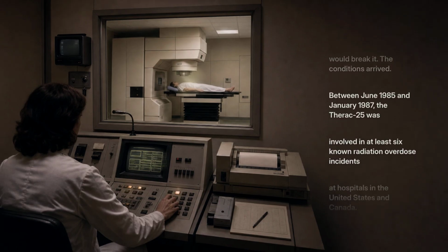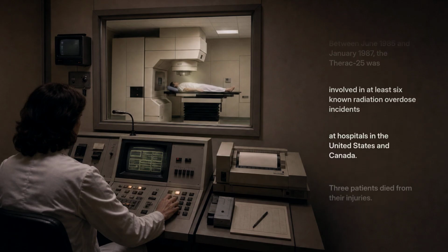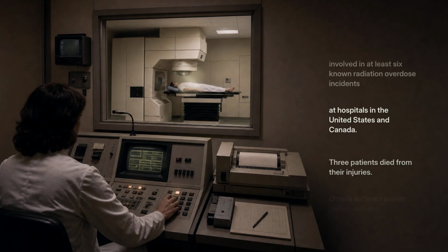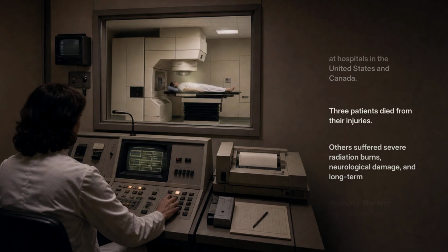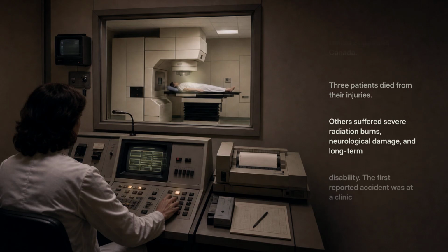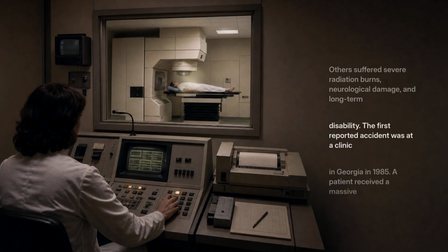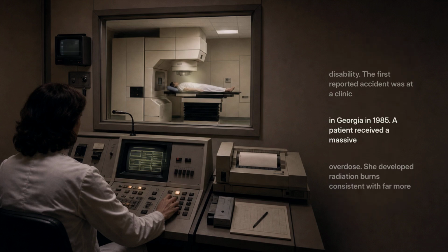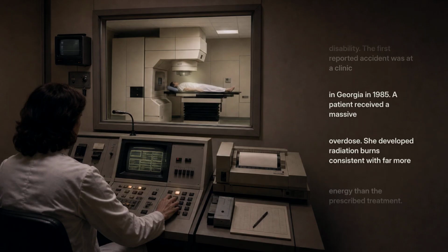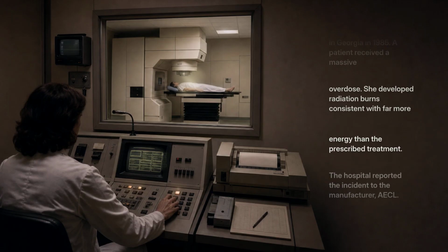Between June 1985 and January 1987, the Therac 25 was involved in at least 6 known radiation overdose incidents at hospitals in the United States and Canada. 3 patients died from their injuries. Others suffered severe radiation burns, neurological damage, and long-term disability. The first reported accident was at a clinic in Georgia in 1985. A patient received a massive overdose.